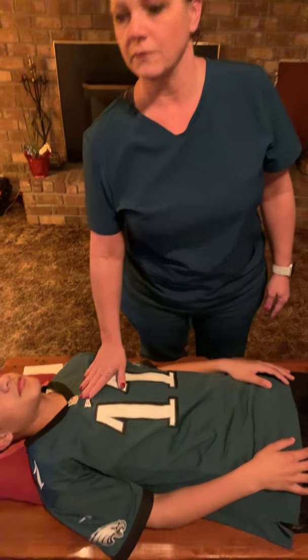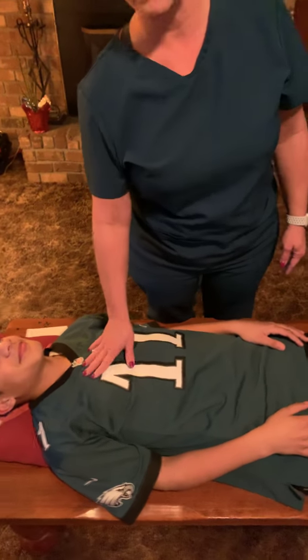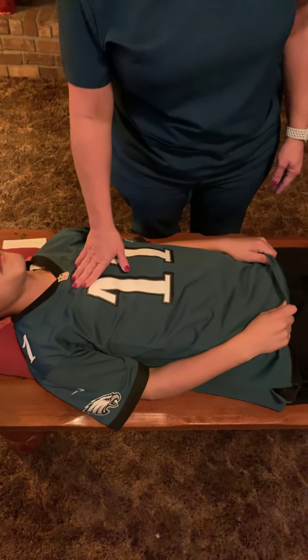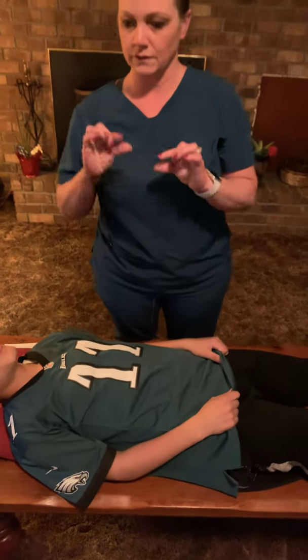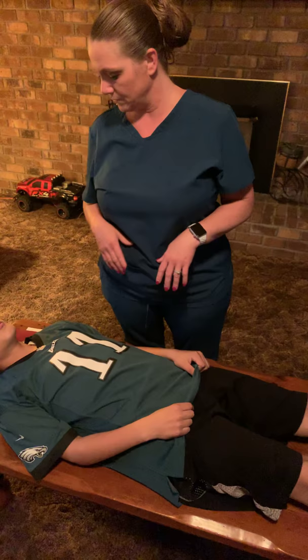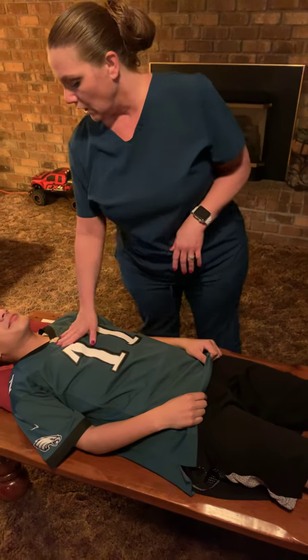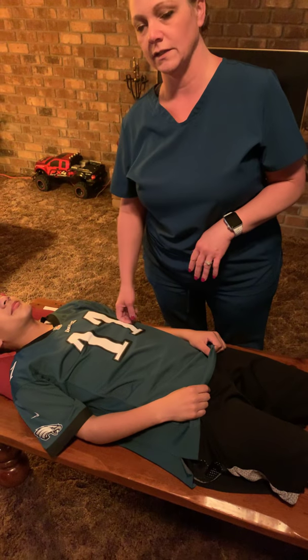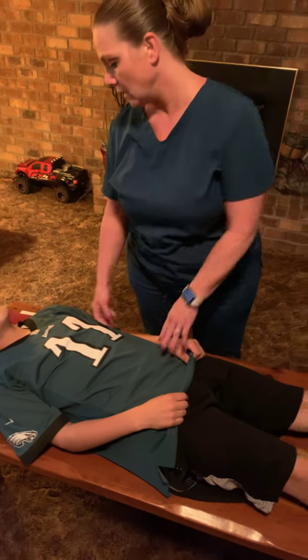If you have a man with a furry chest, we will have to shave it. A lot of females, we use a lot of lotions on our body. We'll have to use alcohol pads because we have these little leads, and unfortunately I didn't bring them today, that we'll have to stick on to the patient's body to hook the leads up to run the EKG.